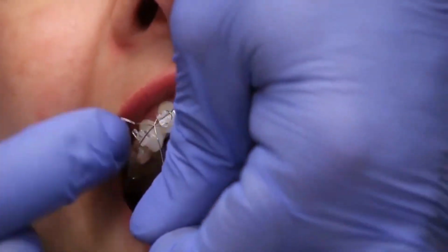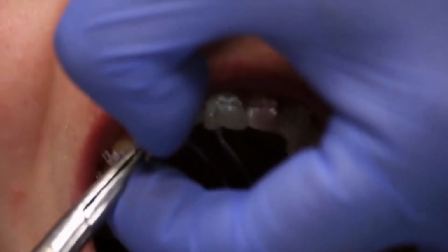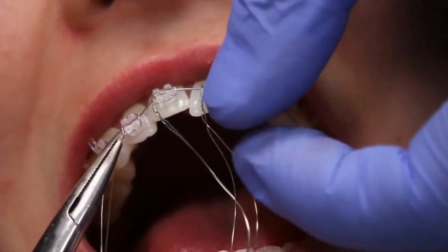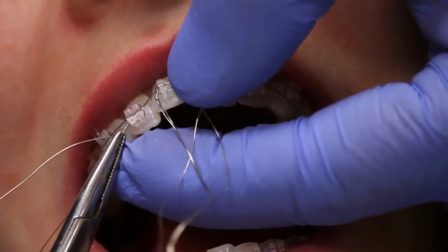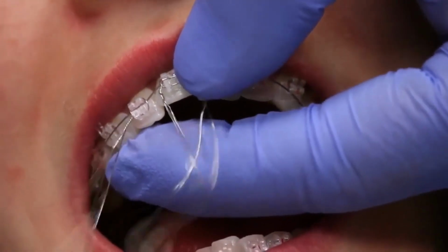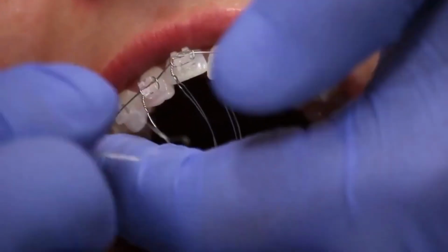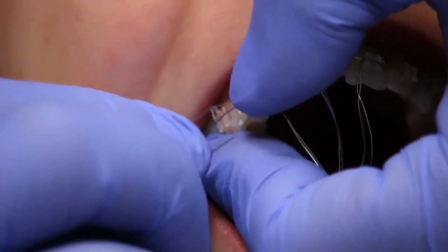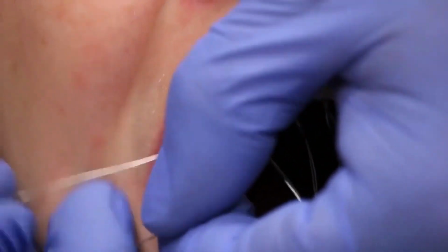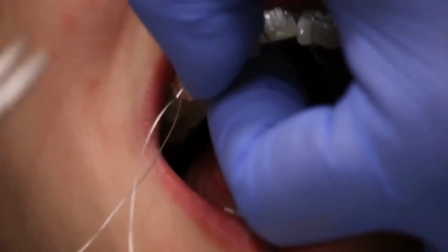Now, notice I tend to put my finger over the tie that I just placed, just so as I grab my pliers, I make sure that the tie is not going to come off that bracket. And again, just slide it through. Twist your fingers, and you have your tie. I typically hold it with my finger right on top of the bracket.